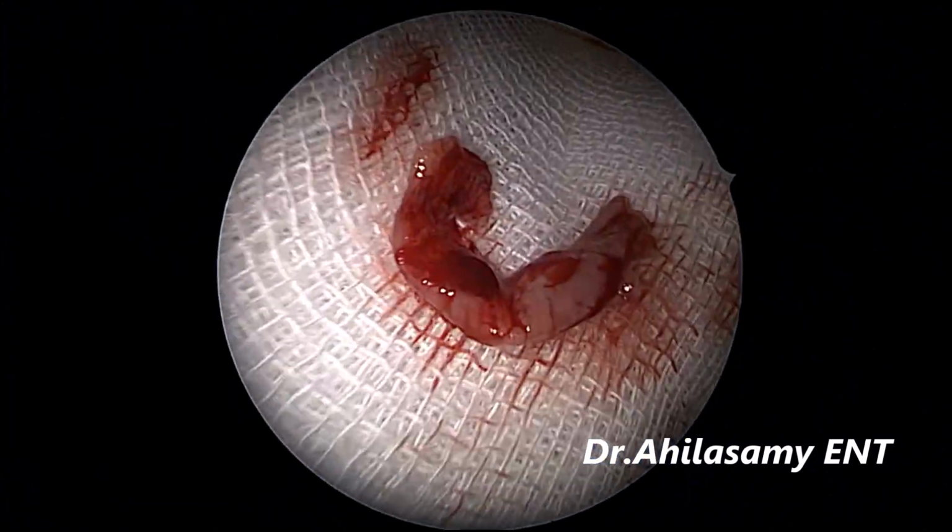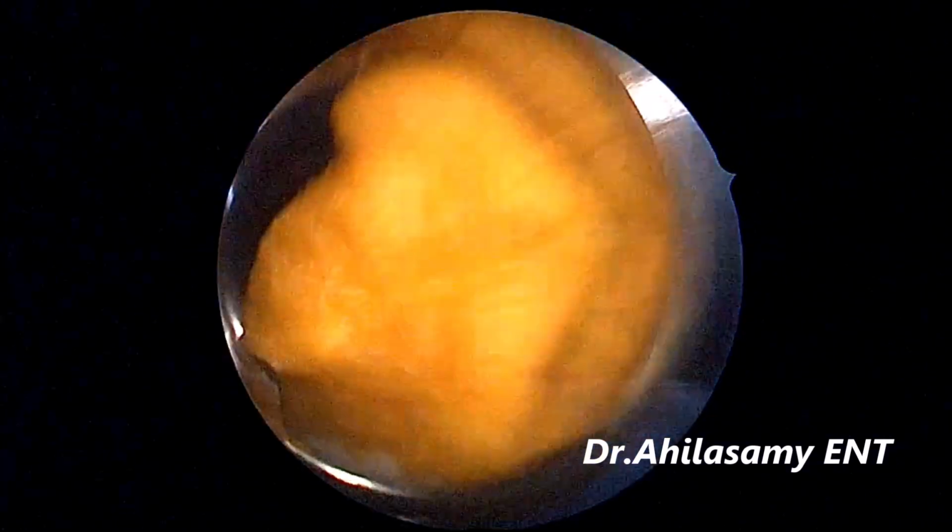Please avoid that. See the C-shaped uncinate completely removed.